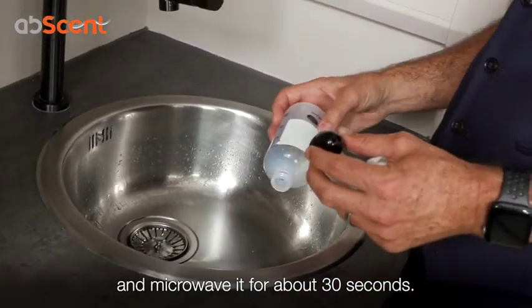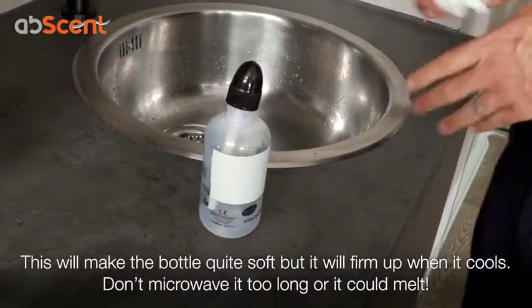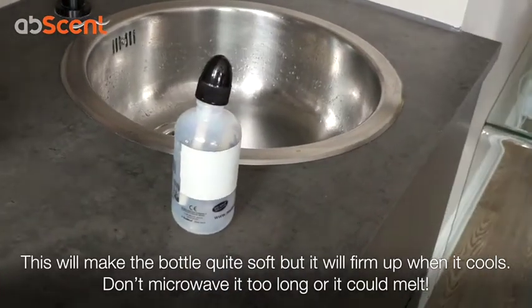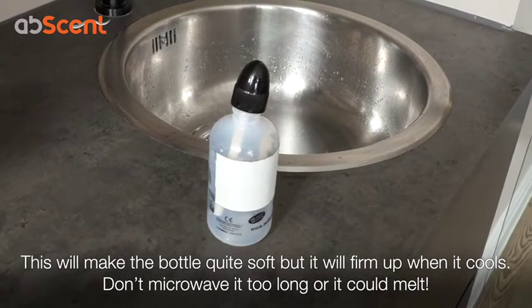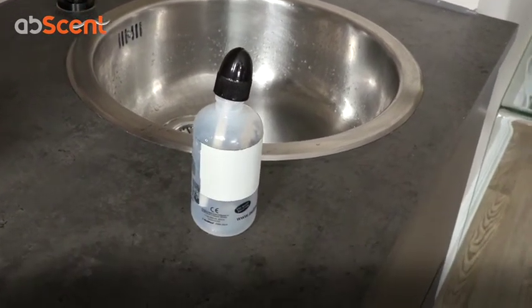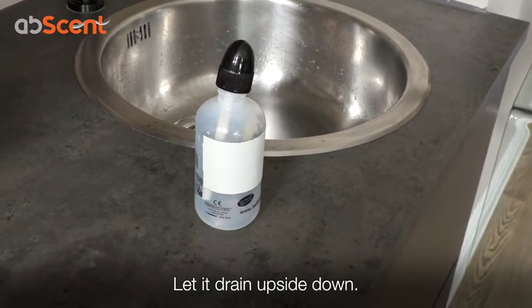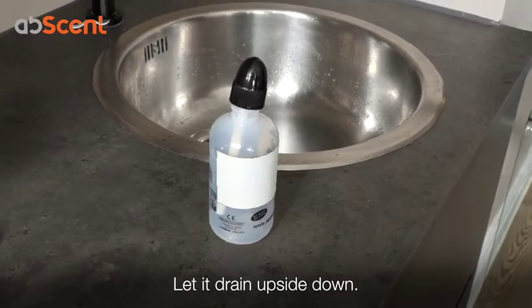This is going to make the bottle really soft — it won't melt it, but I wouldn't put it in for two minutes as that probably would melt the bottle. Microwaving it for about 30 seconds means it really heats up, steam builds up on the inside, and then once that's done, tip it upside down in the little docking station and let it drip during the day.